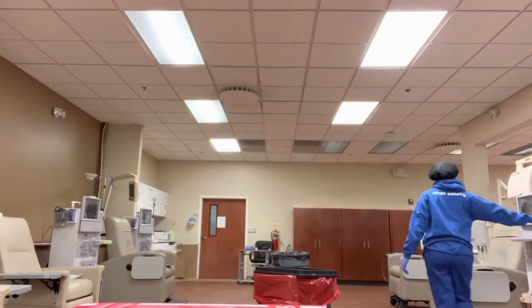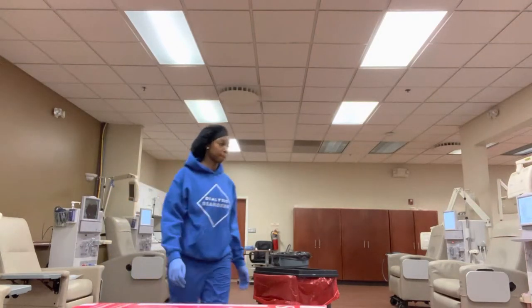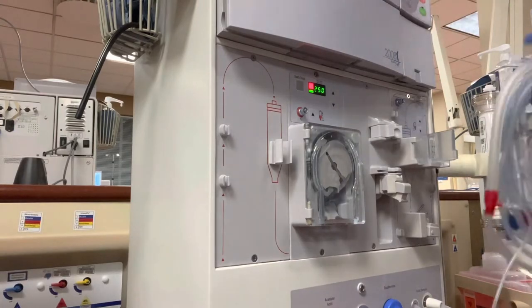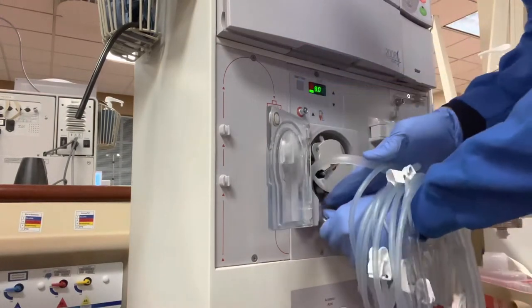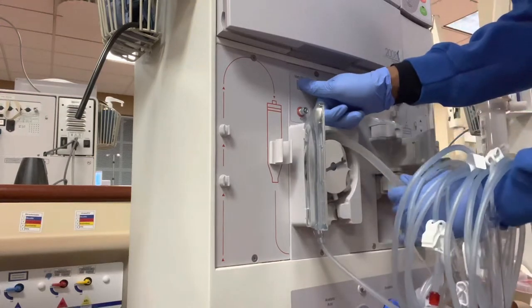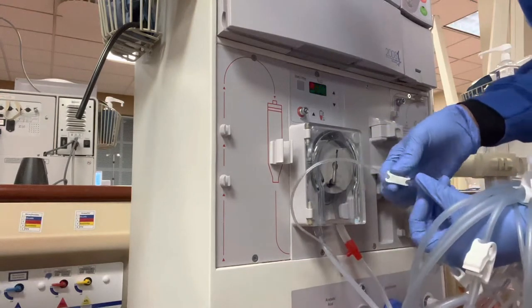Hey y'all, so today I opened and closed, but I did not forget the request that was made to show what clamps to clamp. I want you guys to pay attention. I do it a couple times so you can see how I do it. I tried to slow down. I also did it at a different angle towards the end. So you just watch how I clamp as I go. Again, I clamp as I go.